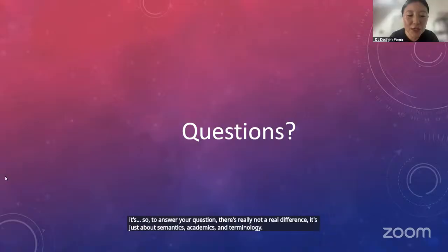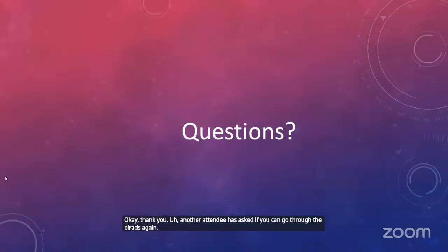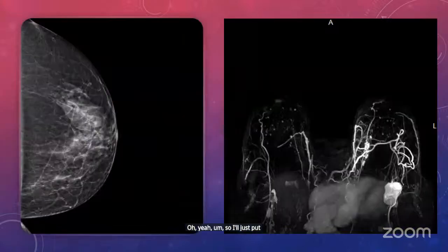Okay, thank you. Another attendee has asked if you can go through the BI-RADS again. Oh yeah. So I'll just put this up.